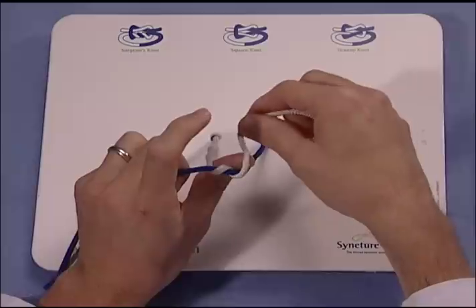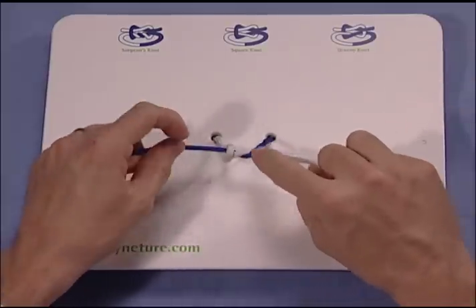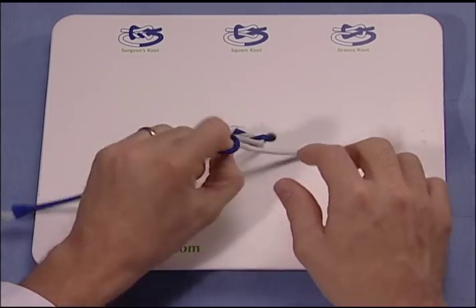The suture is grasped a second time and brought through. This second throw allows for greater knot security in a situation prone to slippage.